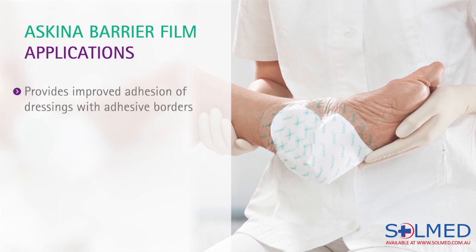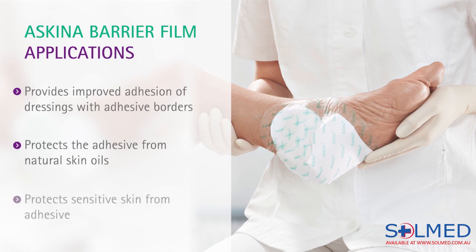Skeener Barrier Film provides improved adhesion of dressings with adhesive borders and/or adhesive tapes. It does this by stopping the natural oils in our skin from coming into contact with the adhesive, thus creating the optimal environment for adhesion. If people have an adhesive sensitivity, this product is also very effective in providing protection.